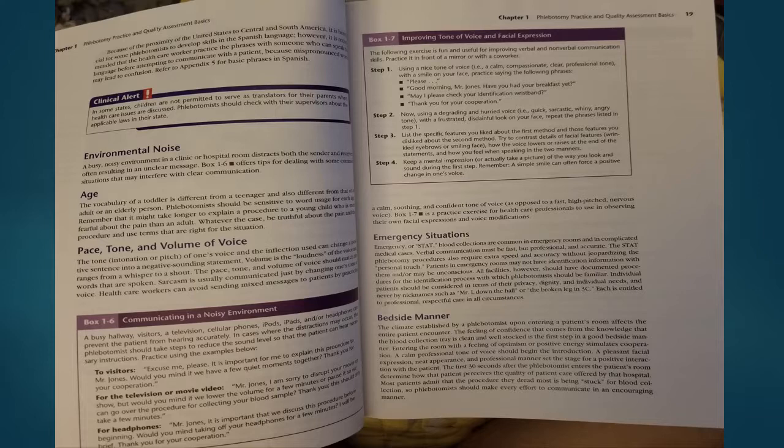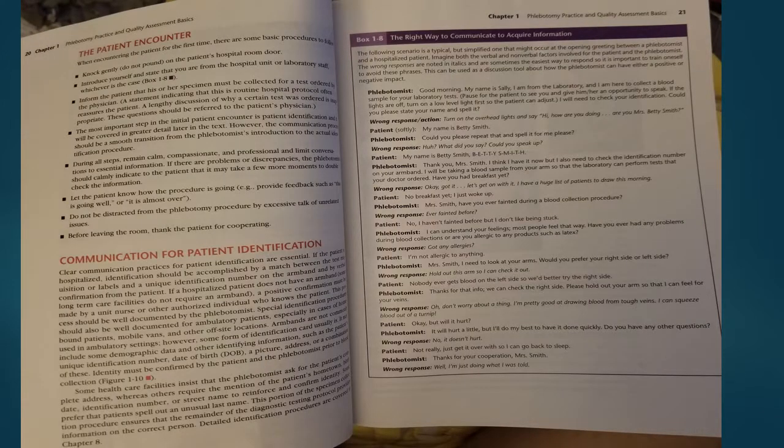The first 30 seconds after the phlebotomist enters the patient's room determine how the patient perceives the quality of patient care offered by the hospital. Most patients admit that the procedure they dread most is being stuck for blood collection, so phlebotomists should make every effort to communicate in an encouraging manner. The patient encounter. When encountering the patient for the first time, there are some basic procedures to follow. Knock gently. Do not pound on the patient's hospital door.